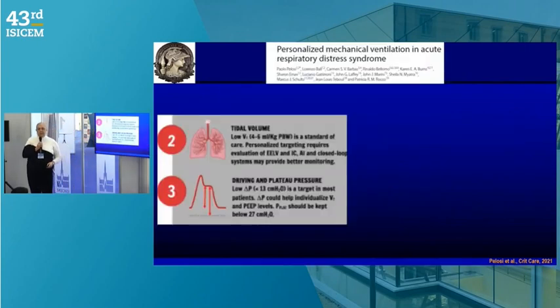Okay, so tidal volume. Tidal volume is around 4 to 6 milliliters per kilo predicted body weight. But now, with this nice group, we are also measuring the end expiratory lung volume. And this is important because we are dealing with moderate, severe ARDS, and it's not easy. We are dealing with the baby lung, and who cares? We have to understand that if you have a severe damage, the baby lung is reduced, and probably we have to focus on which tidal volume we have to measure. And one interesting strategy is to normalize by end expiratory lung volume. Okay, this is a strategy.